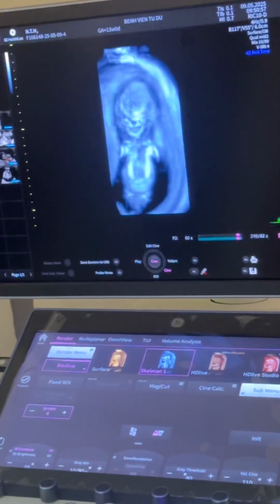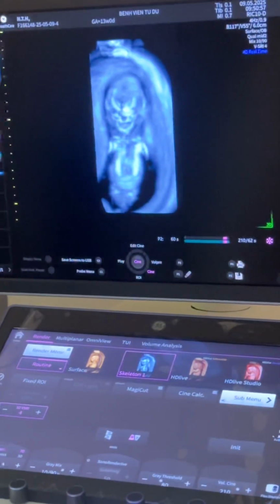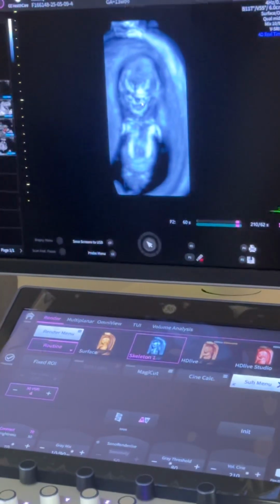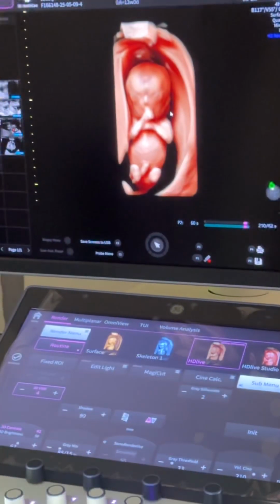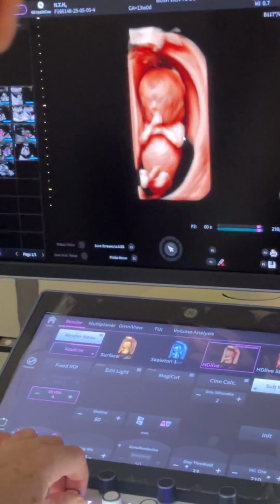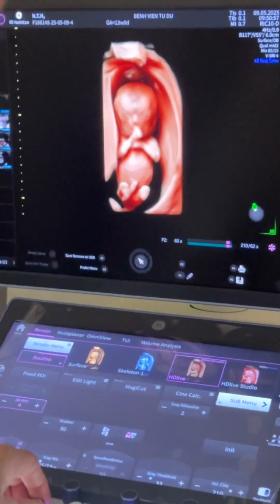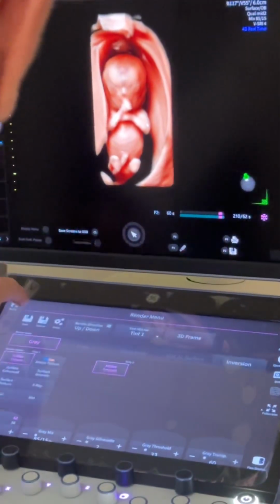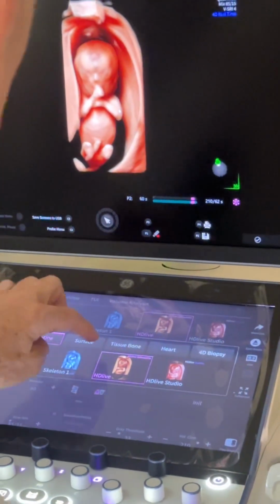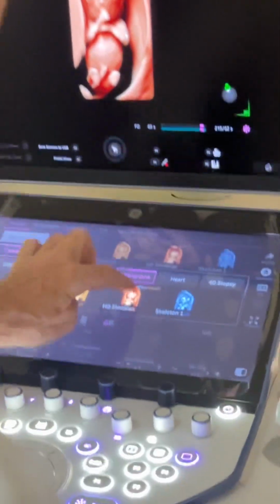You can also, in that same move, if you look on a skeletal rendered image, see the retronasal triangle, the maxilla, and the frontal bones. You can jump in real time, 4D, from these surface rendered modes to skeletal modes. There's also another mode, Long, you may be able to help me out here on this machine. It's the skeletal tissue bone HD Live silhouette.